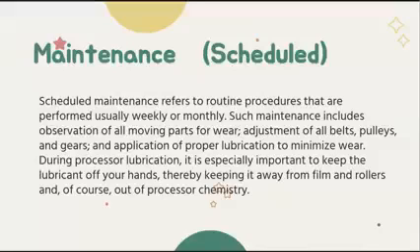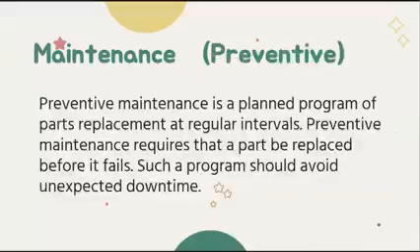Okay? So we do not know what effect the lubricant has on the chemicals. So that is why we have to keep it away from the chemicals, from the processing chemistry. Next, we have preventive maintenance.